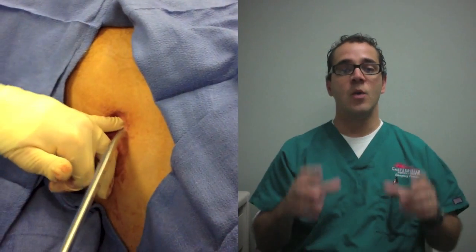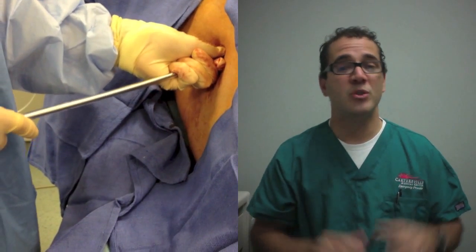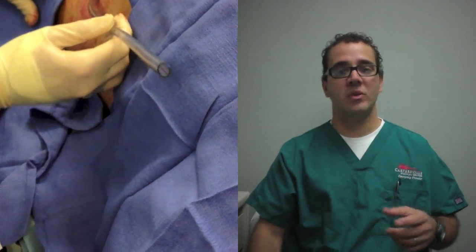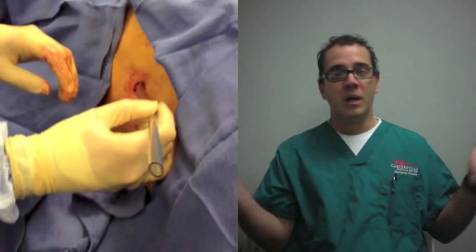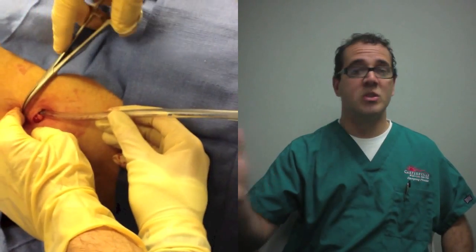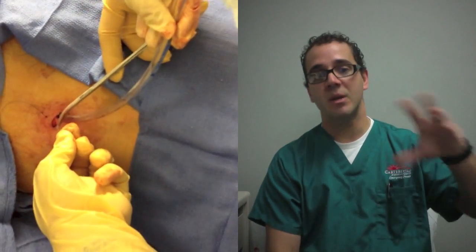As I'm showing in this video, we're using the trocar method, and the doctor is trying to push that in. It does require a fair amount of strength — you're actually stabbing through muscle layers into the chest cavity. If it's for a pneumothorax, you should hear a pop and a whoosh, like opening a soda bottle, because the air is escaping. There should be plenty of condensation in that chest tube, signifying that it's in the chest cavity. Make sure you're in position — the last thing you want is to think you're in, close the skin layers, tie the tube to the chest wall, get an x-ray, and find out you're not even in the chest cavity. You'd have to get another consent, tell the family, embarrass yourself, gown up again, and do it again with a new chest tube, because you don't want to introduce bacteria and infection into the cavity, cause empyema, pneumonia, and all kinds of complications.